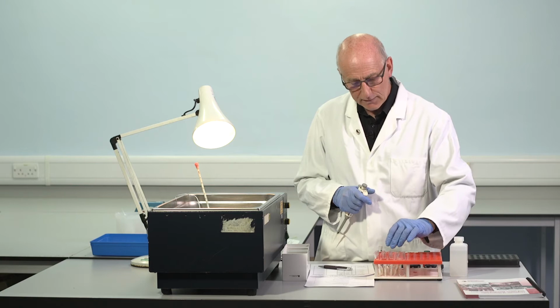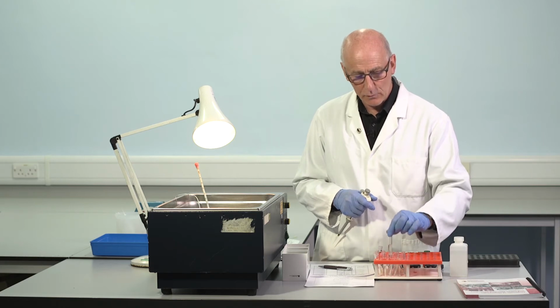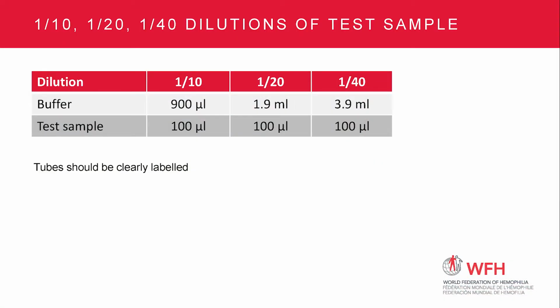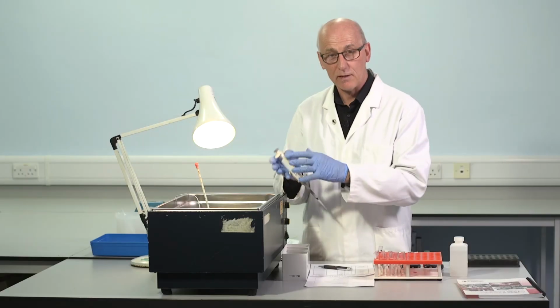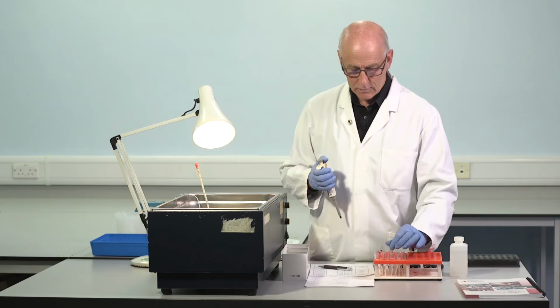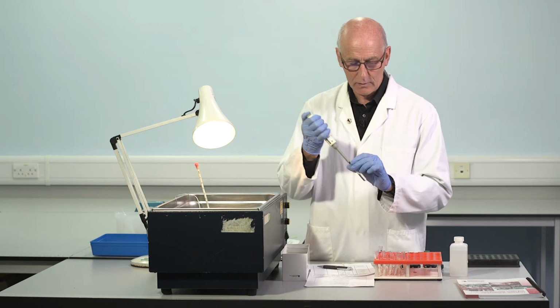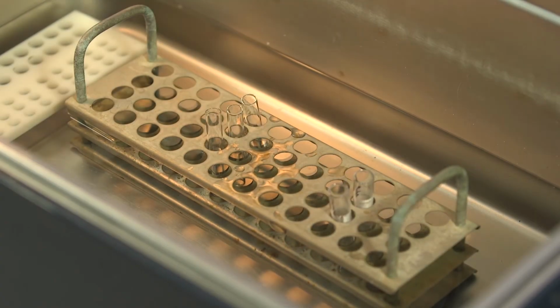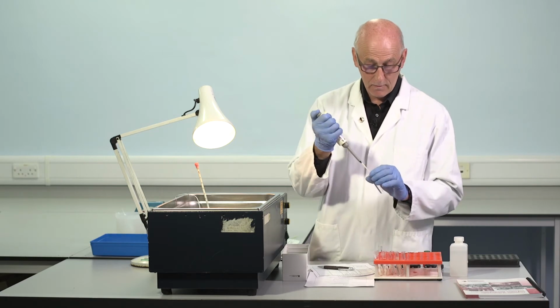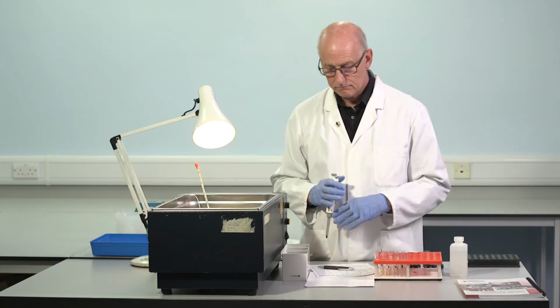I have here 3 dilutions of the first test sample. 0.1 plus 0.9, 0.1 plus 1.9, 0.1 plus 3.9. Make the dilutions into the test. 1 in 10 dilution, first tube, fresh pipette tip. 1 in 20 dilution, next tube, fresh pipette tip. 1 in 40 dilution, third tube. Warming to 37.